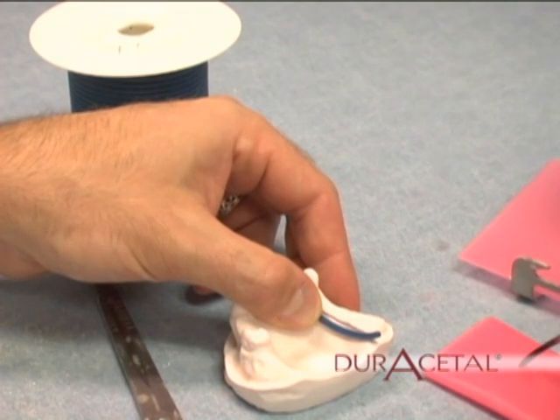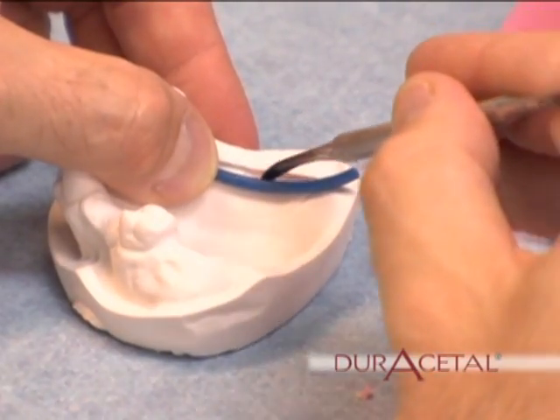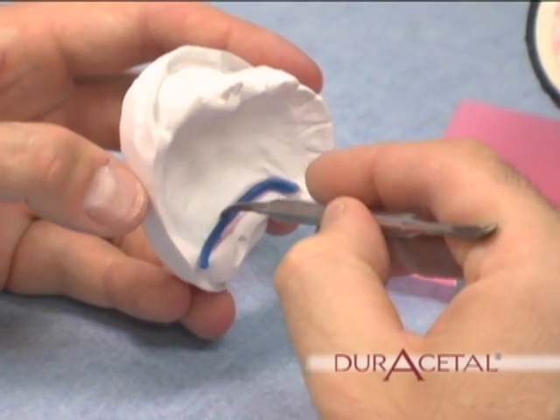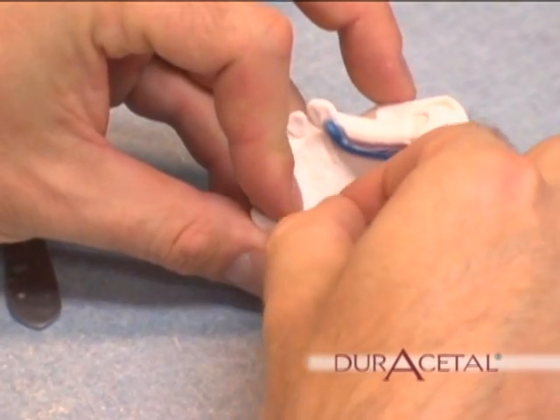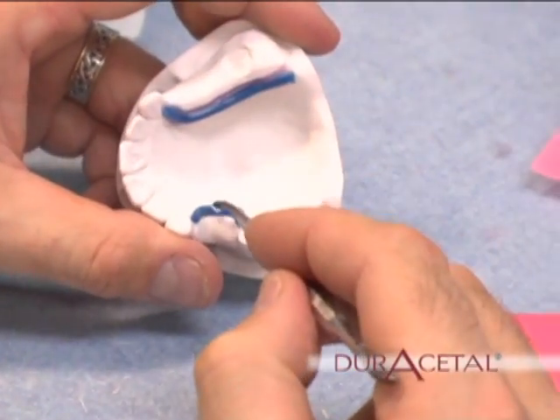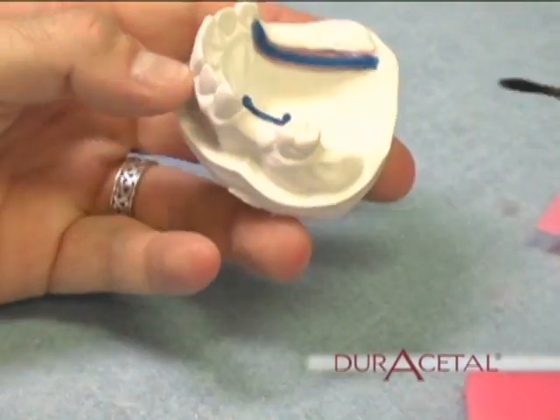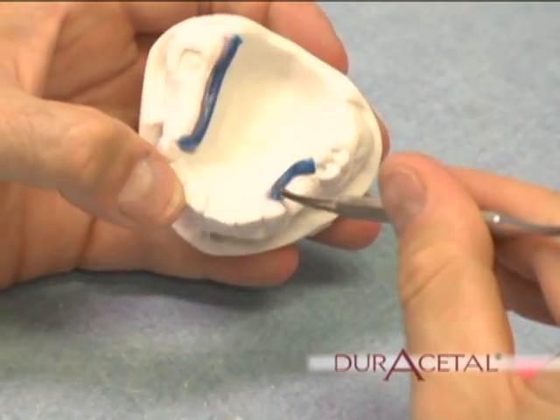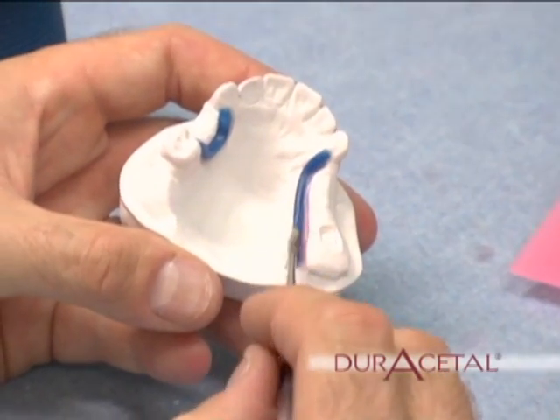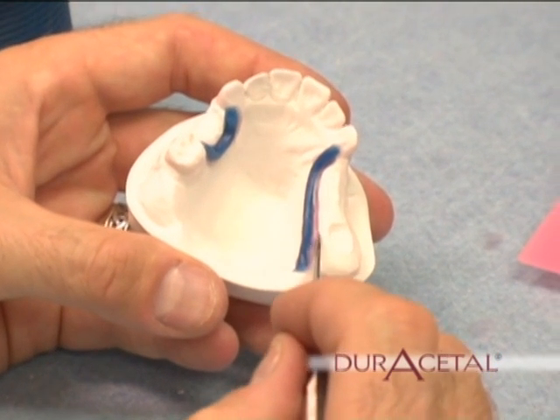Waxing the partial. Place 12 gauge sprue wax about 2mm below the blocked out saddle areas. The blue wax highlights where the blocked out areas are on the model, so you don't overlap finish lines when waxing.